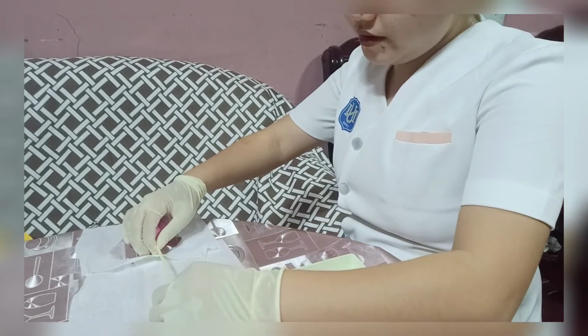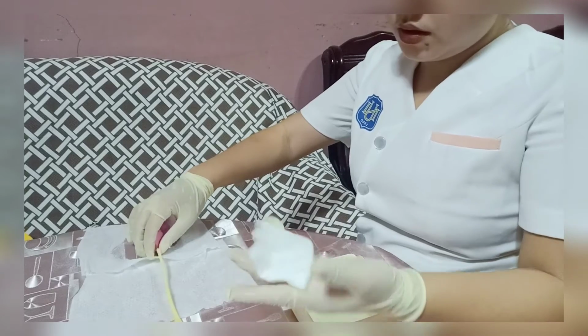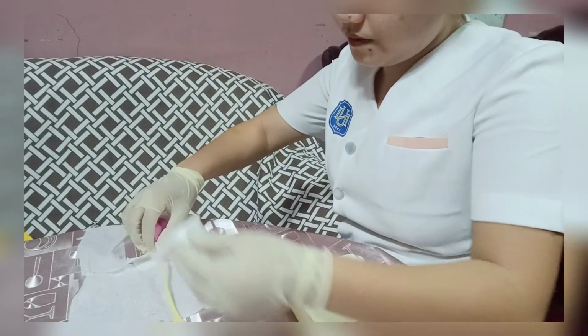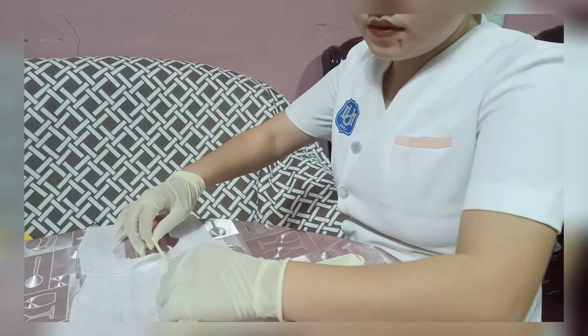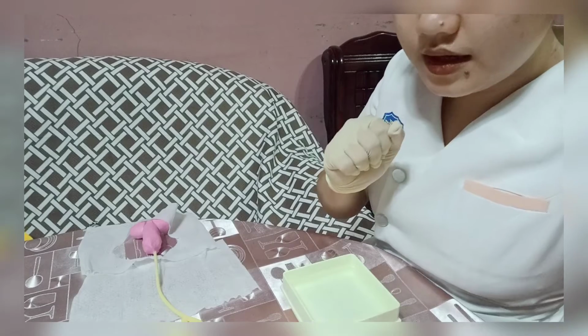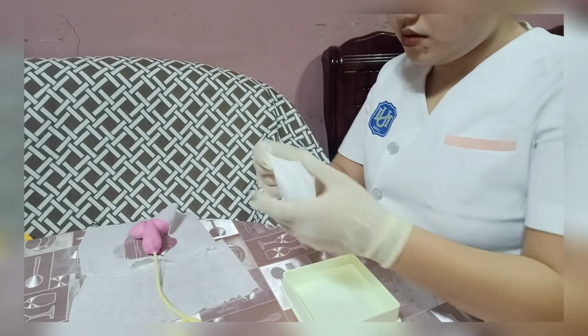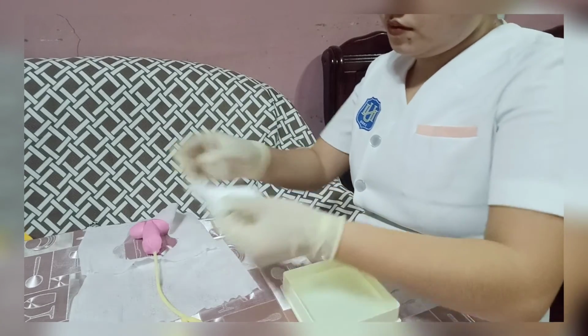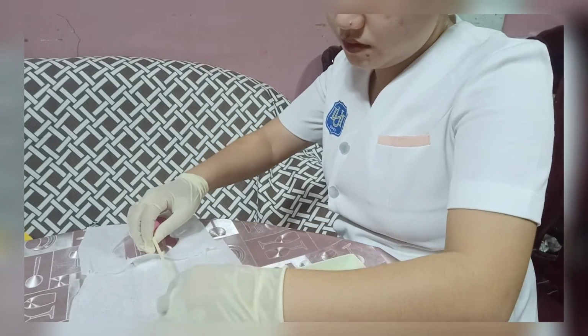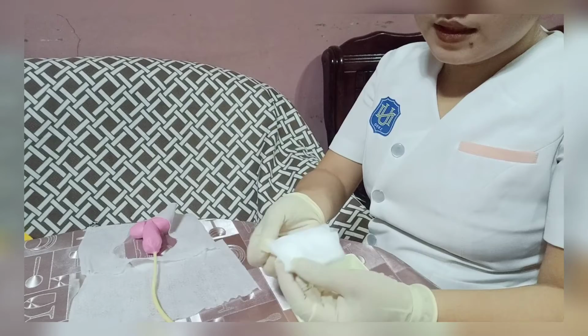Clean in one direction each stroke, and then begin to clean the other side. Repeat it again with another washcloth. Hold the penis on the side.